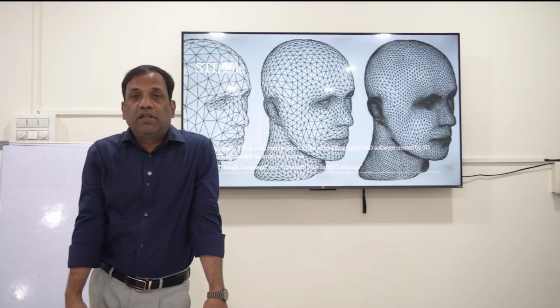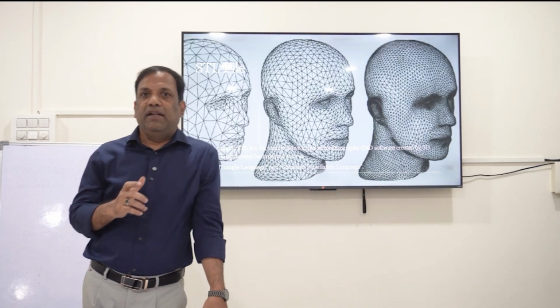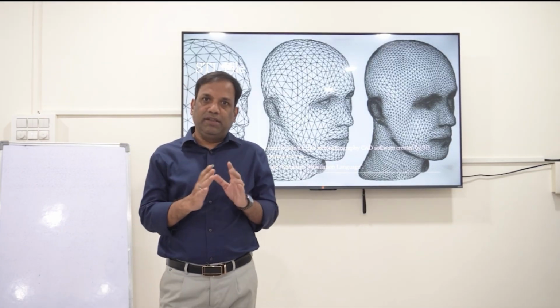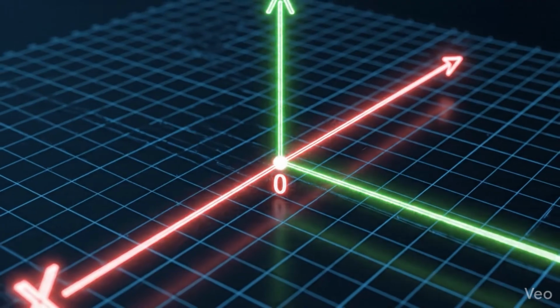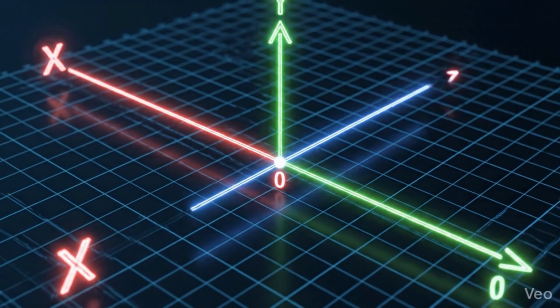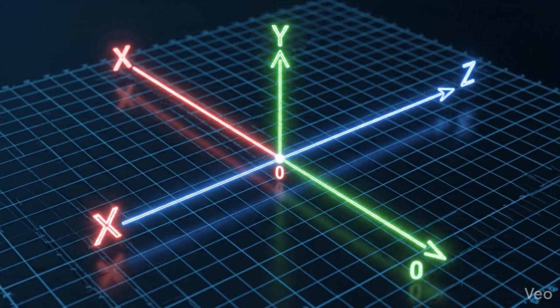Let us first understand how this intraoral scanner works. An intraoral scanner is like a camera only. In a normal camera, what we record is a 2D image, that is the x-axis and y-axis. But in an intraoral scanner, it's a 3D image where we are getting the z-axis also. It's a kind of triangular image.